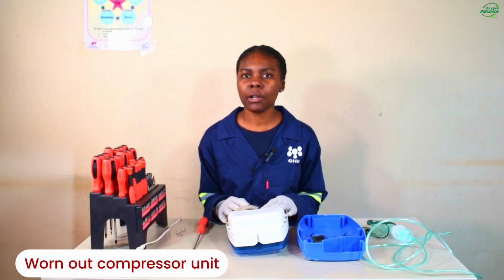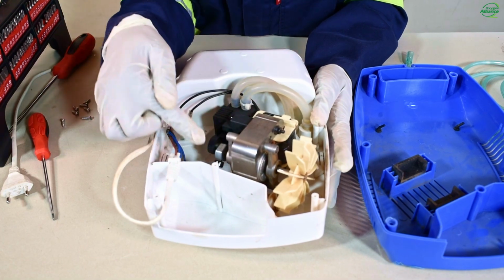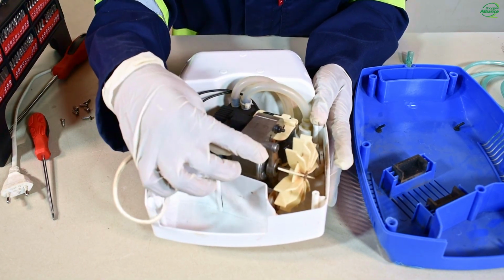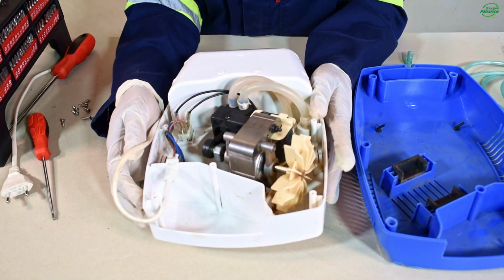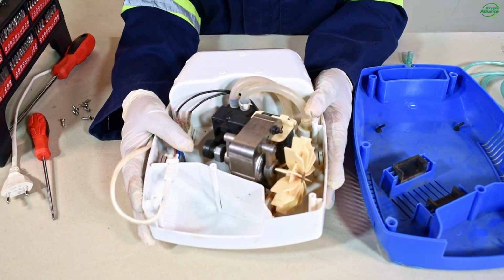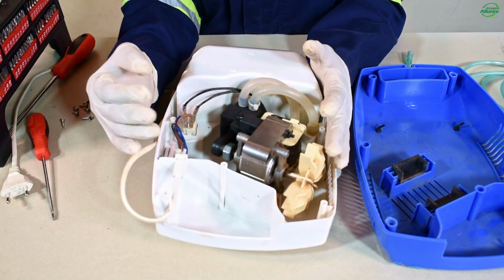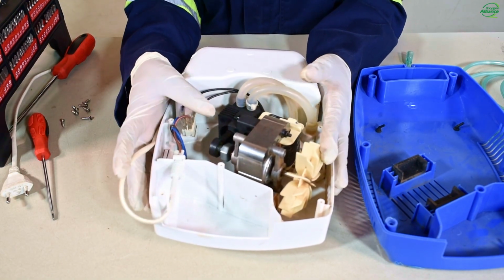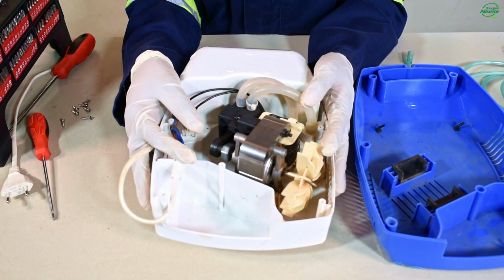Another cause of no mist production is a worn-out compressor unit. The compressor unit comprises a piston, a motor, and a fan. This is the most important component for nebulization, as it is the source of the high pressure required for the process. Over time, components such as the piston may wear out, and this reduces the ability to generate sufficient pressure.